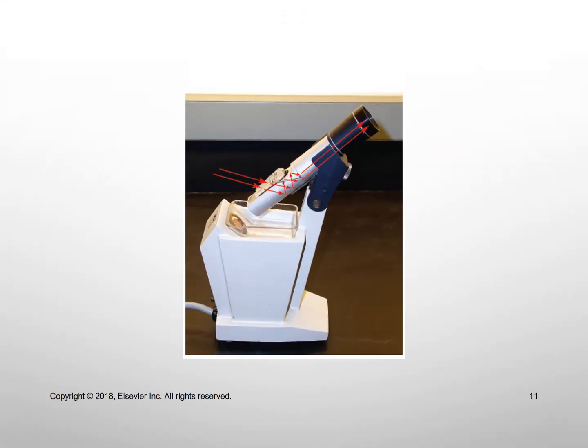And here is an example of a refractometer, where you place one drop of urine onto the lens, and then you use your field of view to look through the monocular and determine the diagram that's going to give you an interface between the two media. You'll get a line, and then you'll get your specific gravity as a value.